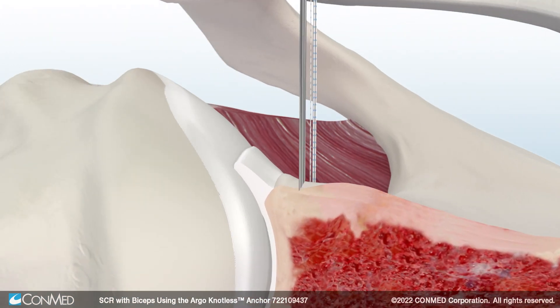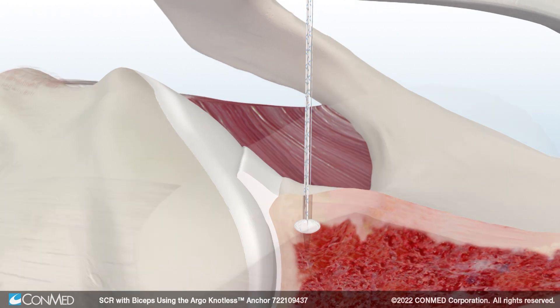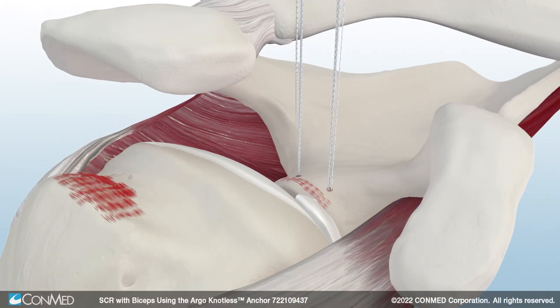Next, insert and set a second double-loaded Y-Knot ProFlex Anchor. Y-Knot Pro Anchors contract vertically and expand laterally to provide 360-degree form-fit fixation beneath the cortex. Then, remove one suture from each anchor.